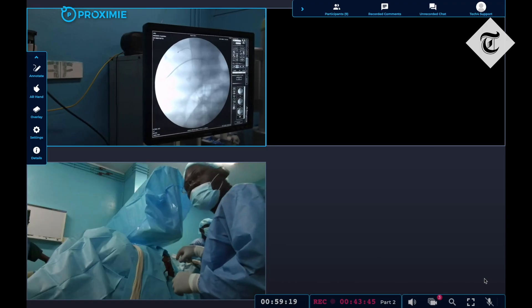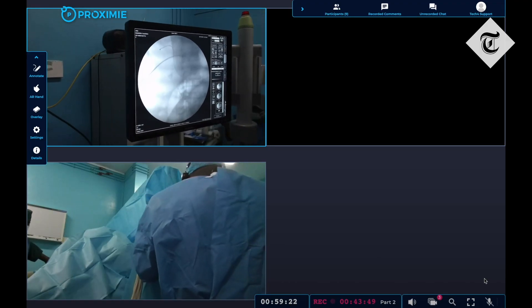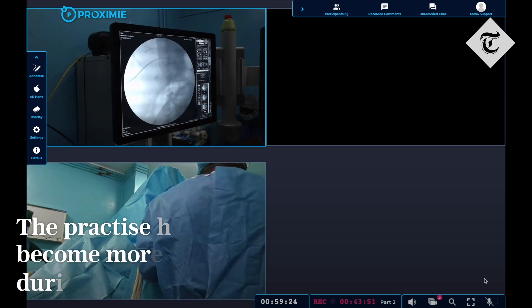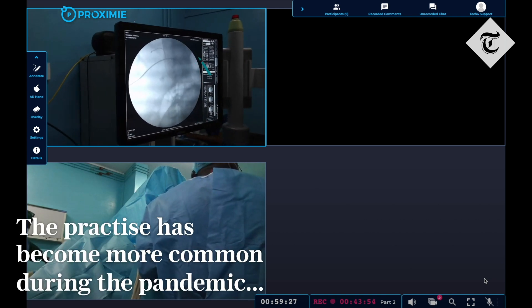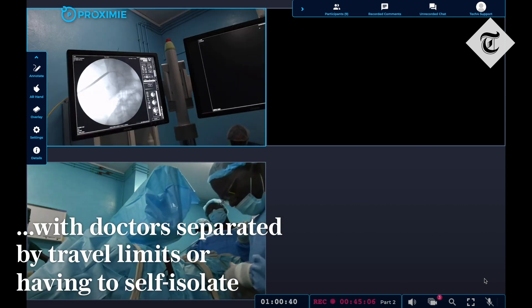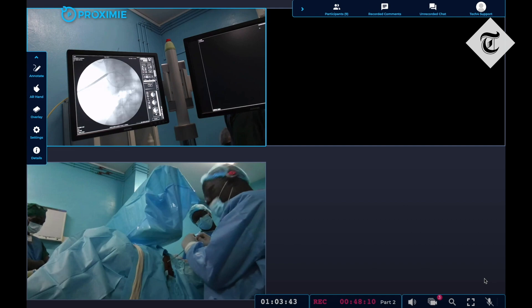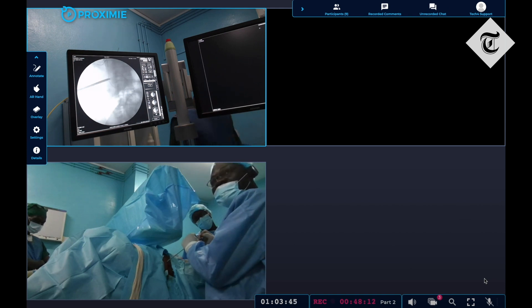Go in with your scope — there was a lot, not just that little piece we can see. Very good. Gil has now placed a second guide wire into the system, and if he now takes out his dilator — yes, now you're good.